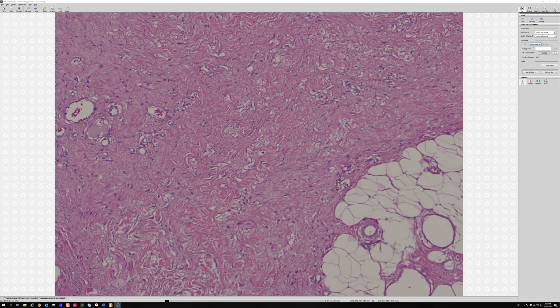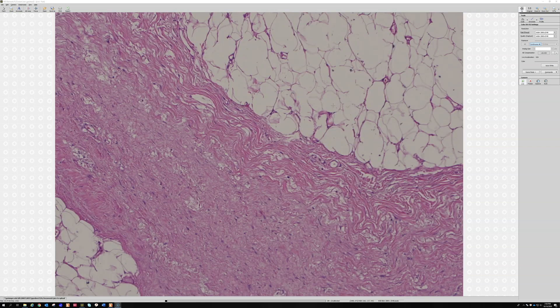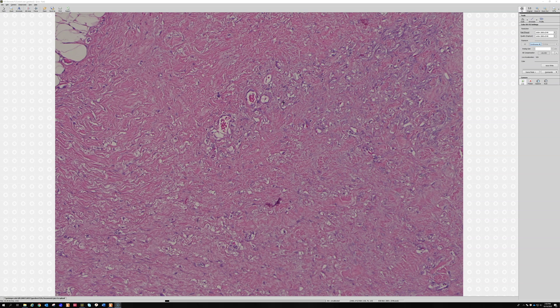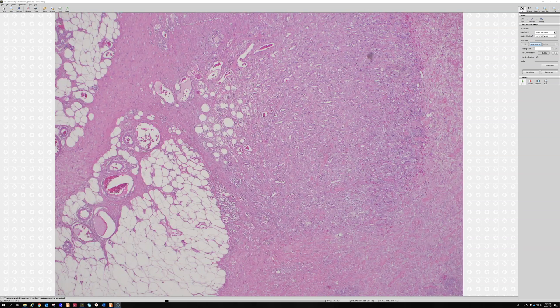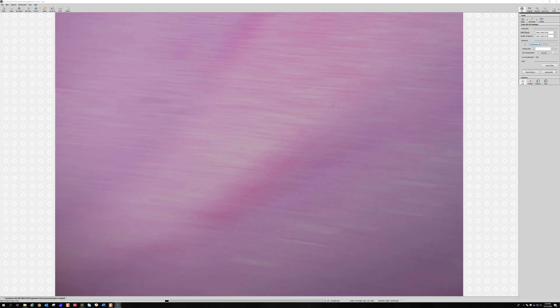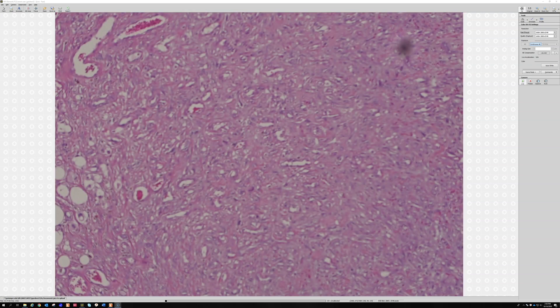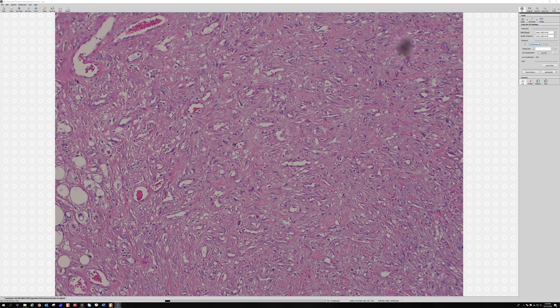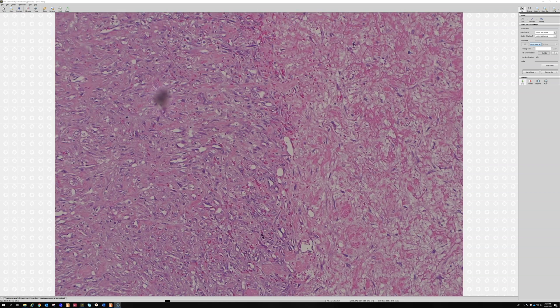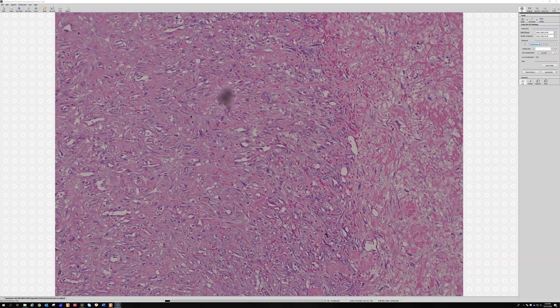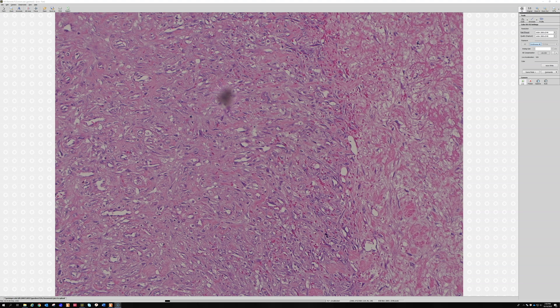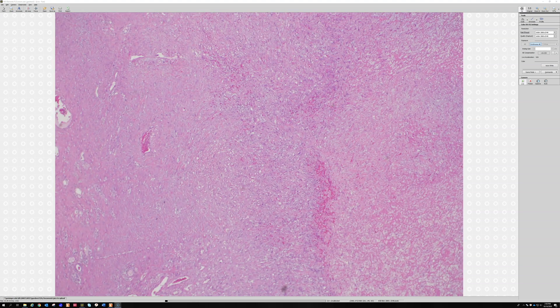It doesn't look as loose and myxoid and granulation-tissue-like anymore — it's starting to look scar-like. You'll often see proliferating blood vessels out around the outside too, looking like granulation tissue: proliferative, revved-up vessels and reactive myofibroblasts. So the zone of ischemic fibrinoid necrosis in the middle, surrounded by fasciitis and granulation tissue, surrounded by scar — that is typical of ischemic fasciitis.